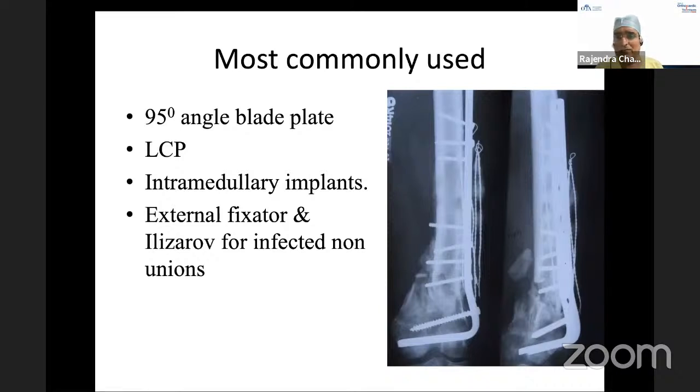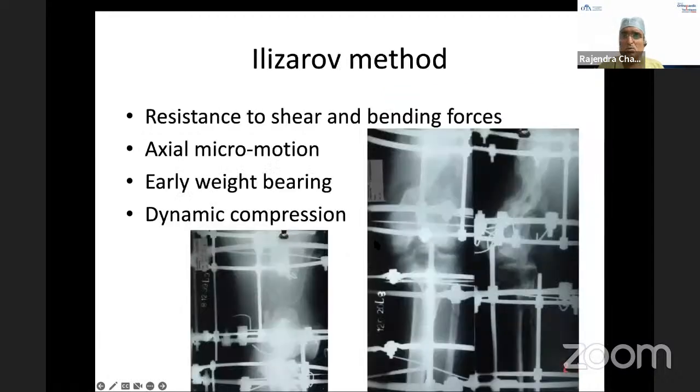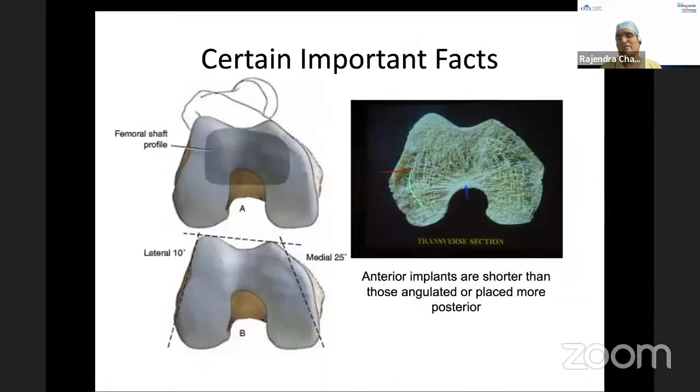We had discussed the 95 degree angle blade plate, as I said, this much distance, Deshpande sir just pointed out, this much is minimum where an oblique screw can also go and then you can use that. Ilizarov, very rarely nowadays, I don't think in the last 10-15 years we have used Ilizarov for a distal femur non-union. Even if infection is there, with a masquelet technique and a cement spacer with a lot of good antibiotic elution, the internal constructs are better now.